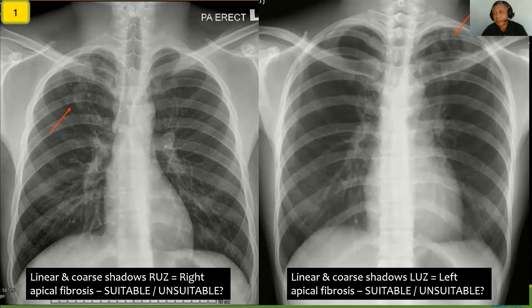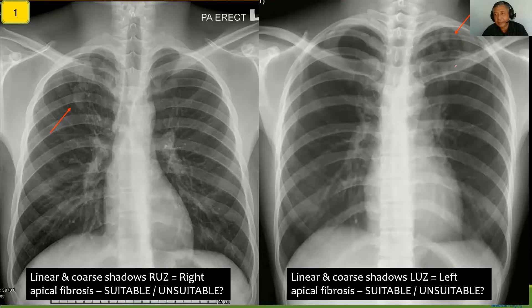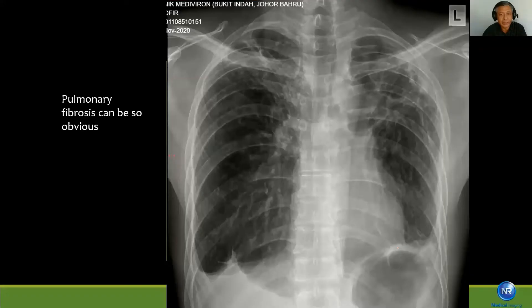The image on the left here is showing similar findings — linear and coarse shadows in the left upper zone. So this will be left apical fibrosis. Both cases will not be suitable for employment in Malaysia.